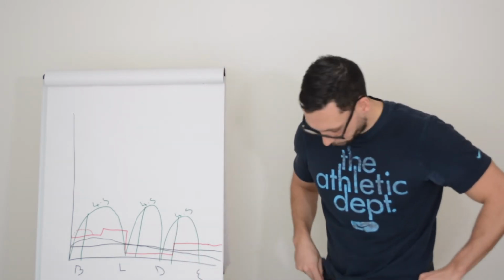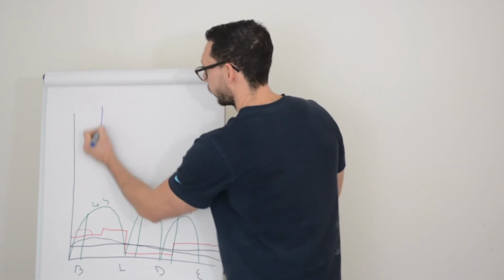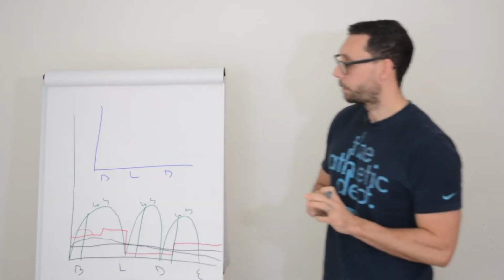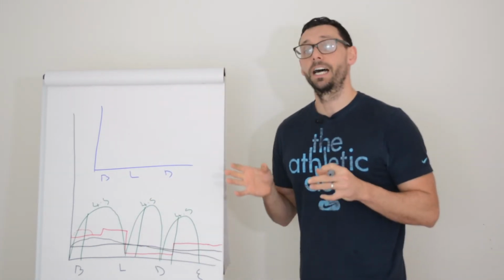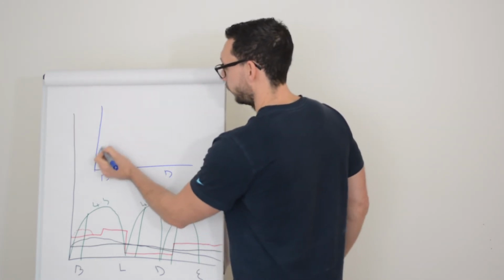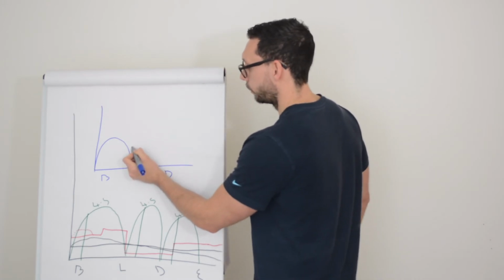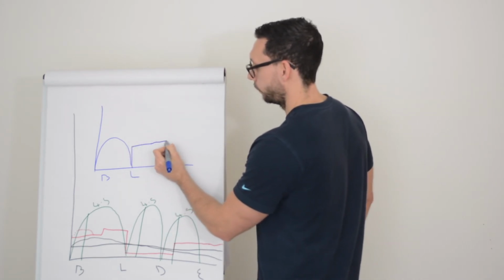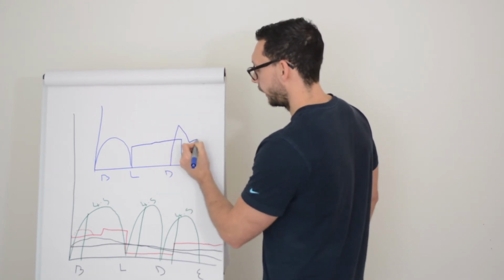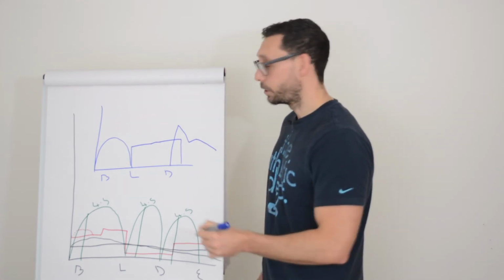Now pumps, again, have a bit more flexibility here. So with pumps, in fact, let's just draw another one up here, just so it's not getting too messy. So depending on what you're eating, you can actually change how that bolus or rapid insulin is delivered. So rather than just have the standard 4.5 hours, what you can actually do is start to prolong the dose. So you can draw it out over a period of time, or you can deliver more at the beginning and then give a little bit more later. So these are things called square waves or multi-wave doses.